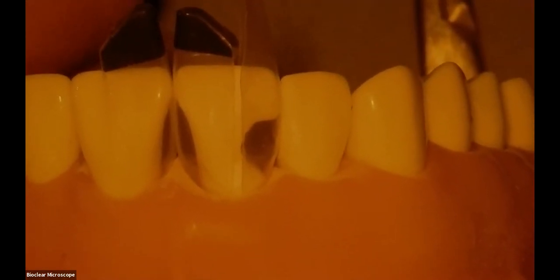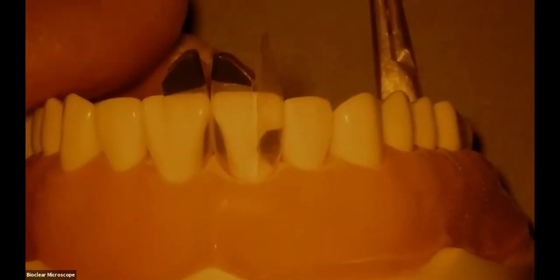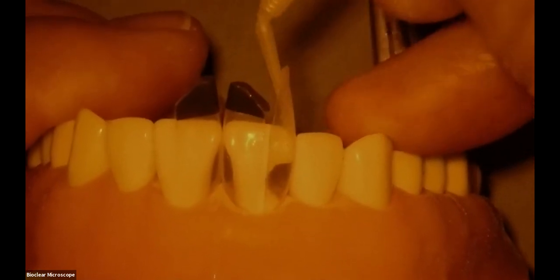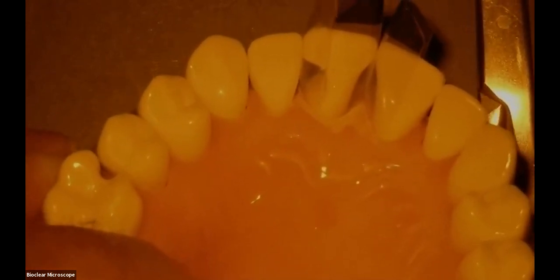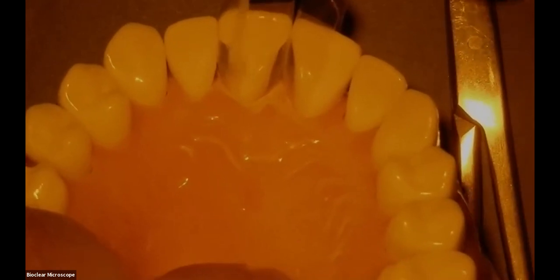Go. So that's 10 seconds. Okay, moving the filter away. All right. And now we're ready for injection molding. There's 3 phases of injection molding. Number 1 is adhesive as a surfactant. So now we're going to go ahead and get the entire complex wet. Remember, we have acid etched this previously. We just didn't show you this because it's a dentiform. So now your job is to simply get the tooth very wet with adhesive as a simple surfactant. A little more adhesive, please.